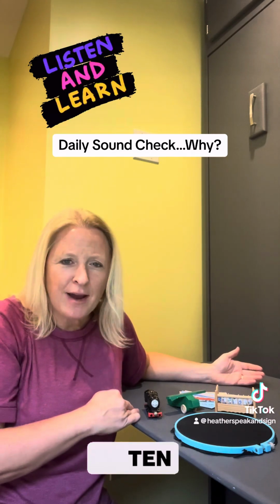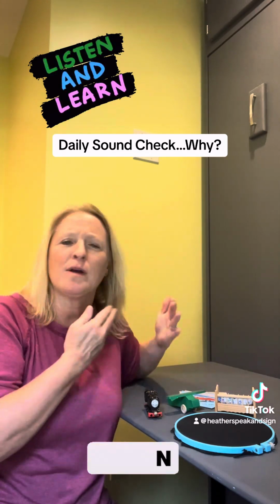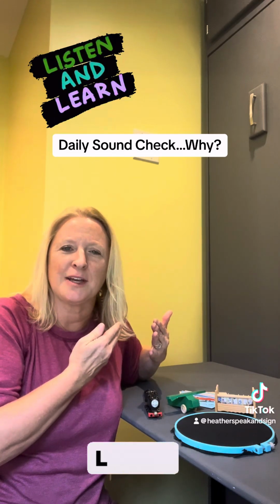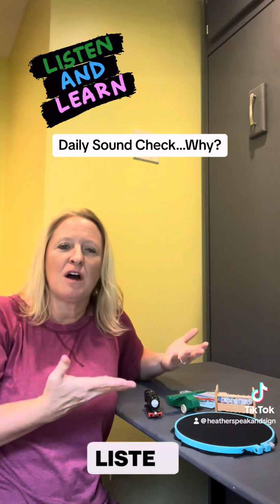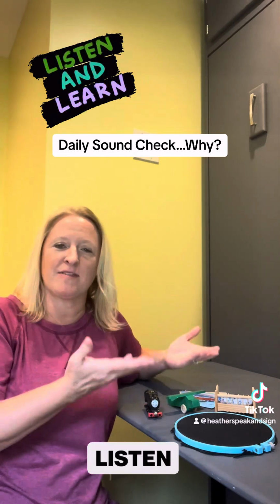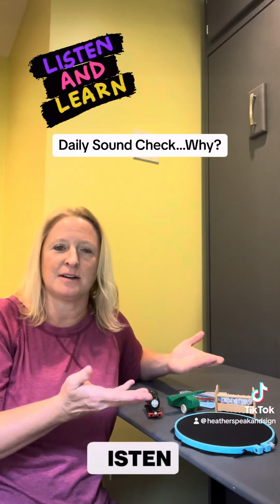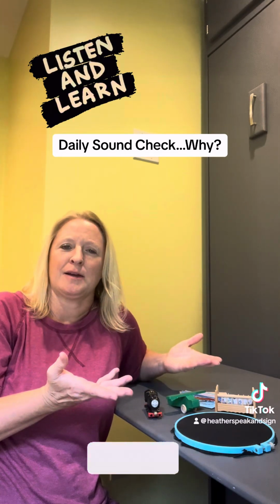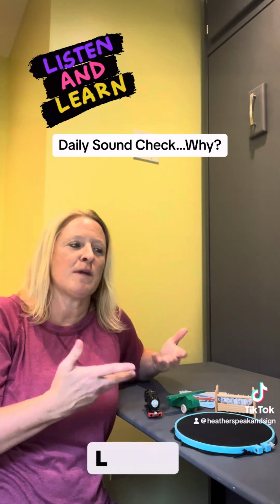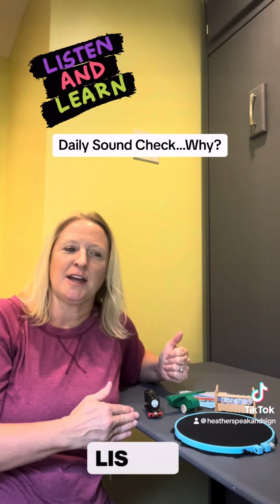Do they have a dead battery? Is their equipment not quite functioning properly? Do they have a cold? Do they have allergies? We need to know what they can do, so we have that baseline, and then we have to keep data so that we can say, oh, today something's off. Why? What's different? And we need to know that maybe they're just having that bad hearing day.